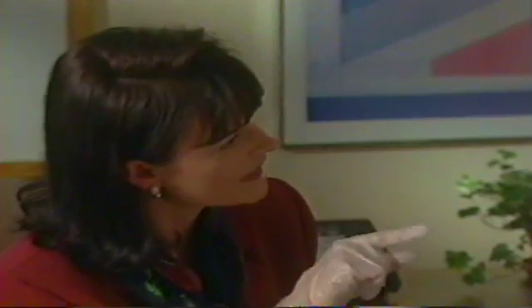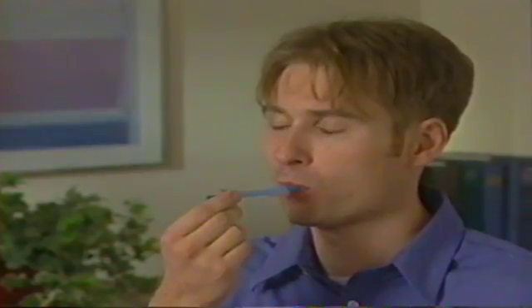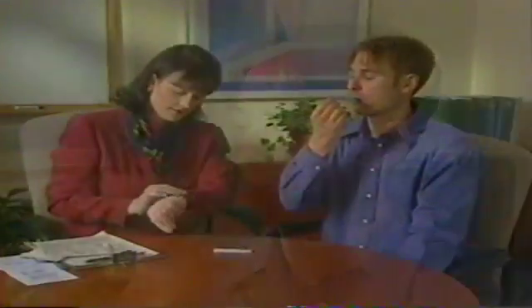Encourage the subject to pucker their mouth to accumulate oral fluid prior to inserting the collector. Now ask the subject to place the foam collector into their mouth and move it around. The subject may gently press against the foam with their tongue to encourage absorption of the oral fluid. Keep in mind that the subject should not chew or suck on the foam collector. The collector should remain in the subject's mouth for 2 minutes to allow the oral fluid to enter the foam.